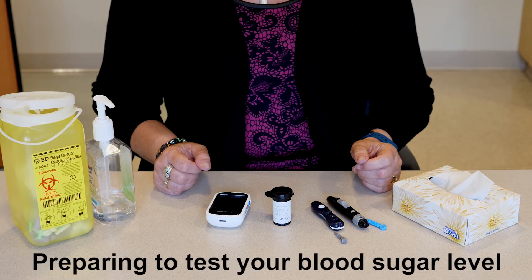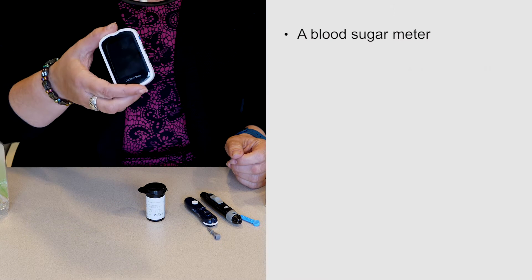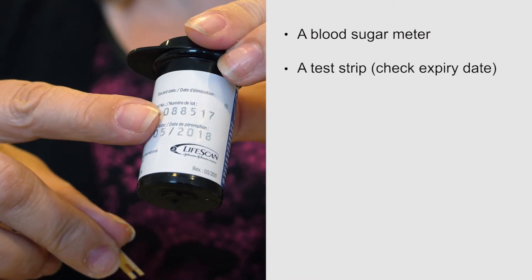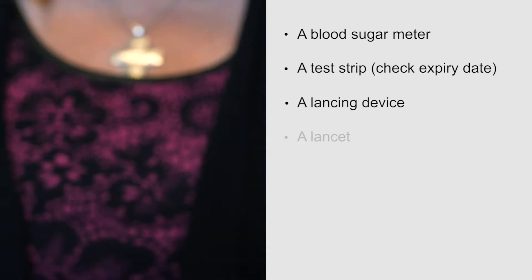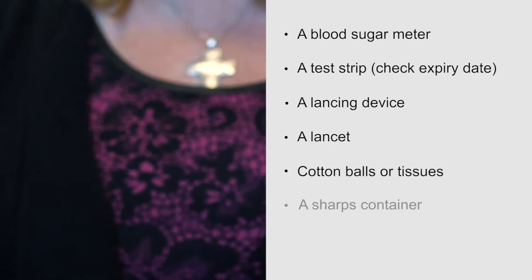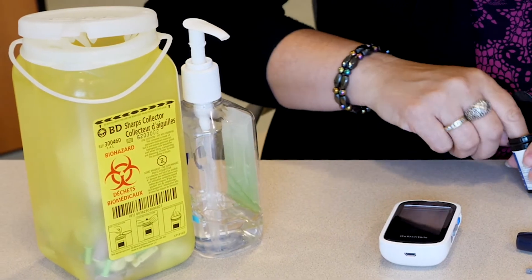Part 1: Preparing to test your blood sugar level. To test your blood sugar level, you will need: a blood sugar meter, a test strip (be sure to check the expiry date), a lancing device, a lancet, cotton balls or tissues, and a sharps container. This can be obtained from your pharmacy.